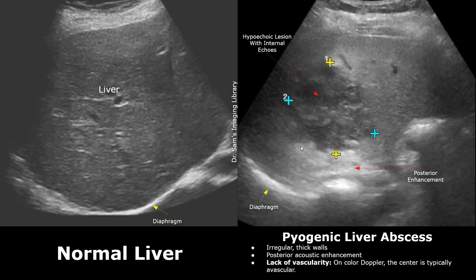Posterior acoustic enhancement always occurs behind fluid-filled structures, so this feature lets us know that it is a fluid-filled structure and not a solid mass. A solid mass will not have posterior acoustic enhancement. When we apply color Doppler, we will not see any internal vascularity inside an abscess — it will not have any blood flow. This lack of vascularity on Doppler is another feature that helps us in distinguishing an abscess from a malignant lesion.